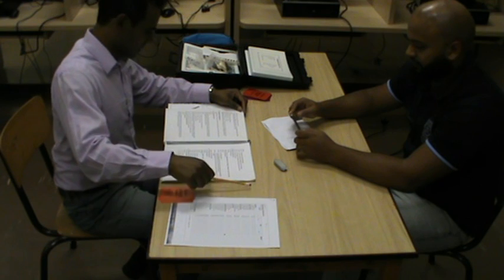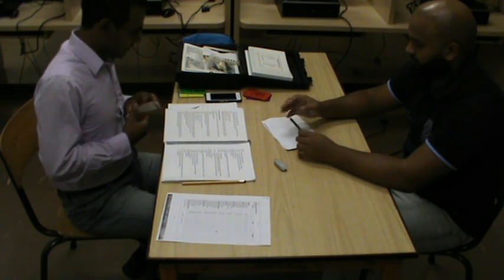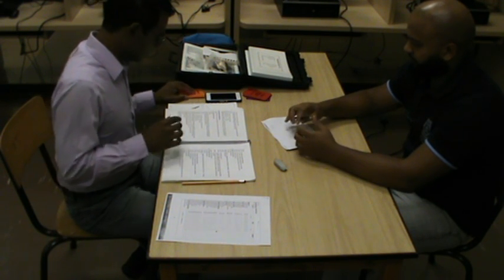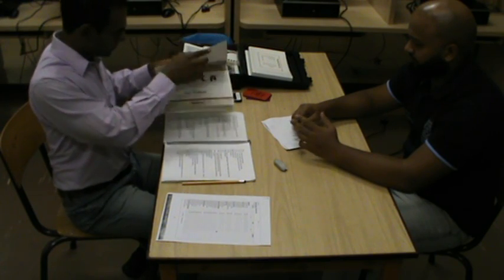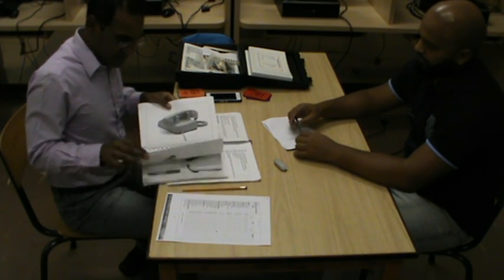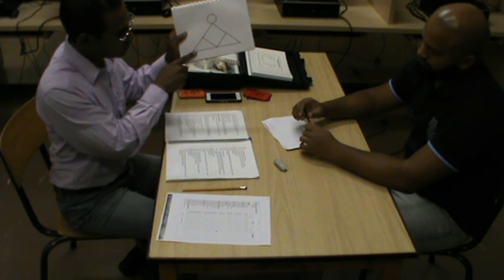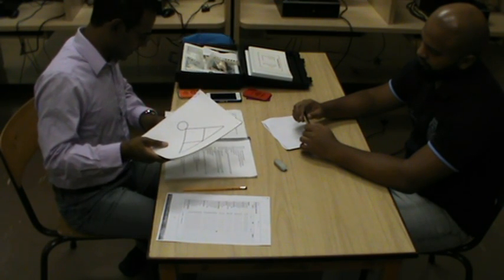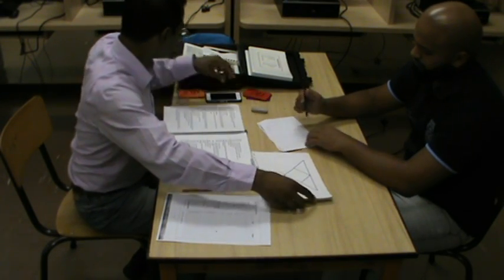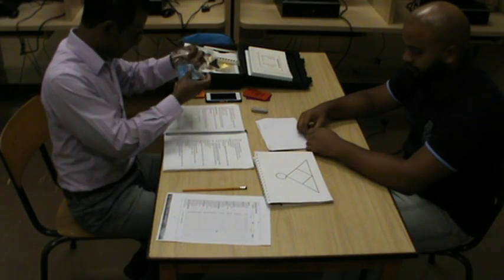The next section, students, focuses on the reproduction of a two-dimensional model. What you will require here, so you need to make use of this test booklet again. You're going to turn to page 20 in the test booklet. You'll see that's the shape on page 20. And you will ask the client to design or place shapes. You see these blue shapes, a circle, a triangle, a square, etc.